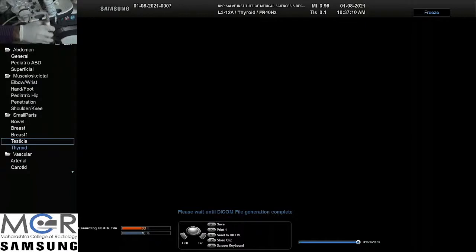So she has history of complaints on the left side. So now we begin our examination on the left side. We'll just wait for 1 minute.